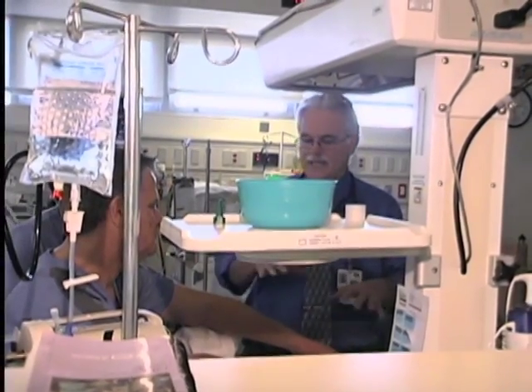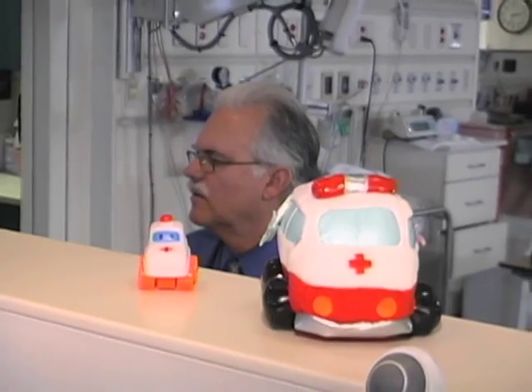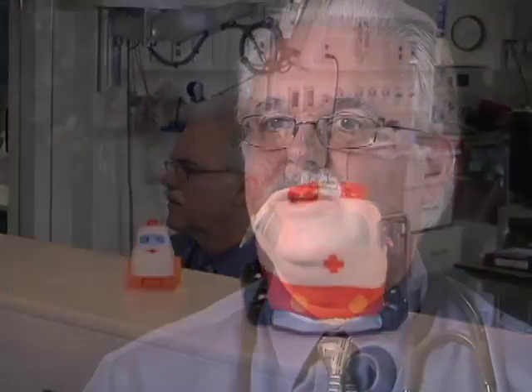According to Dr. Shaw, babies can tolerate the cold temperature of the cooling blanket. They tolerate it really well. Their heart rates do slow a little bit, kind of like somebody in hibernation. They sometimes need to have assistance with breathing, and of course they need to get nutrition, which we can give them as well during that period of time. And we just let their bodies stay kind of on pause.